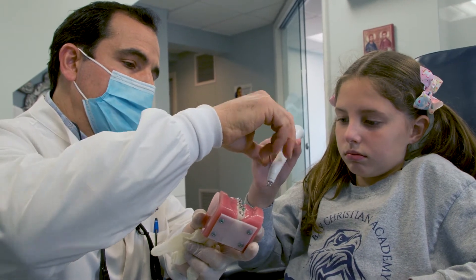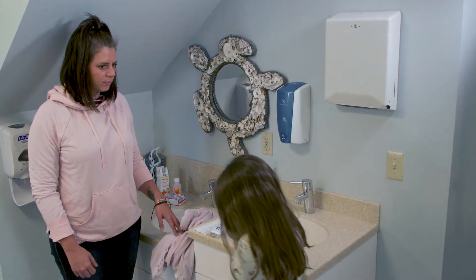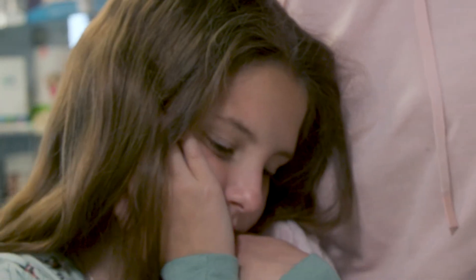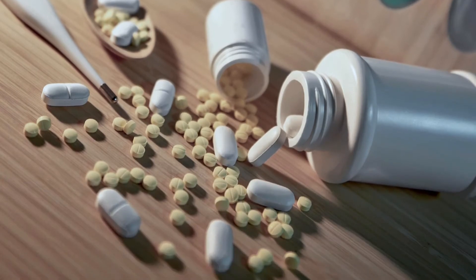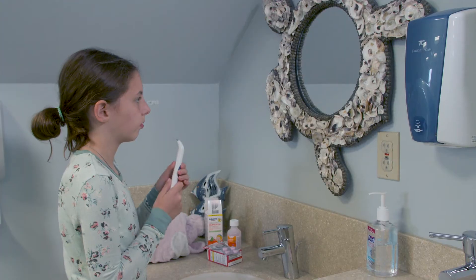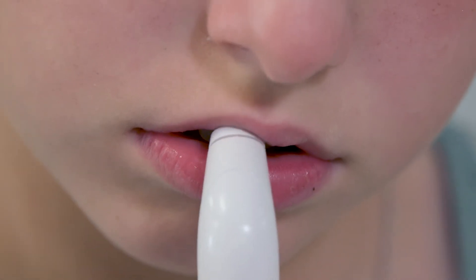Using the Dental Pain Eraser is as easy as brushing teeth. Before the Dental Pain Eraser, I hated seeing Liliana in constant pain all the time with her teeth and her mouth. We were giving her anything to try to help the pain, and I really don't believe in giving a lot of medications. This device is really, really simple to use, and it alleviated all of her pain.